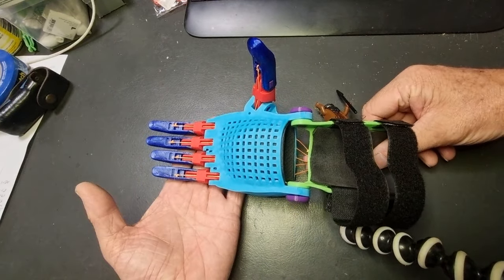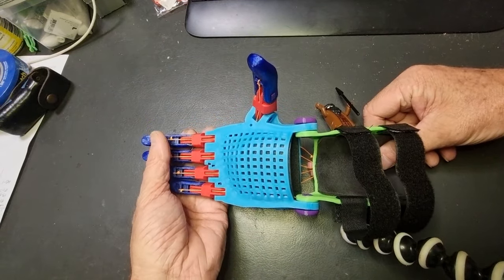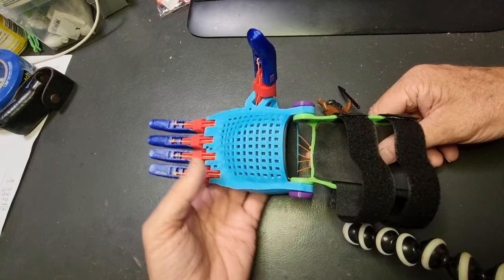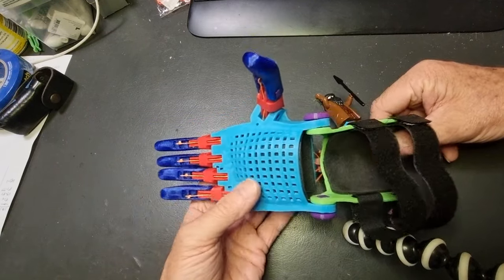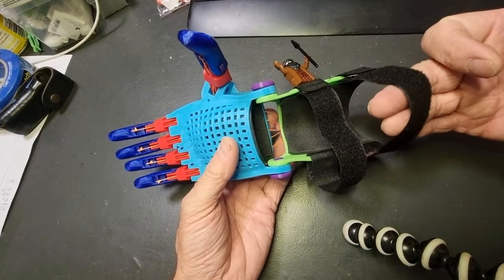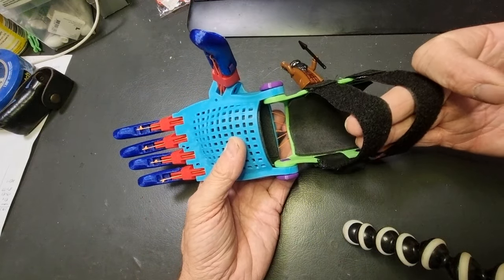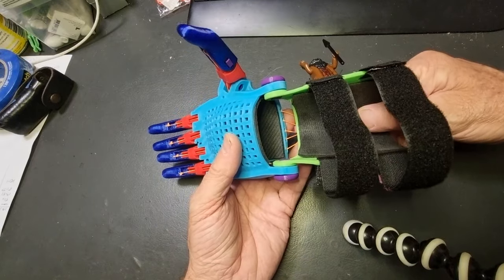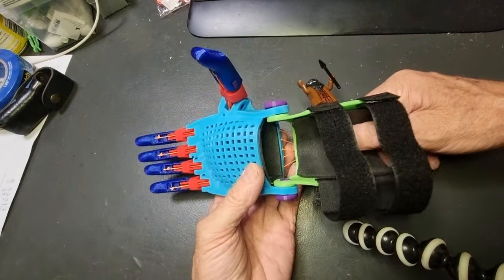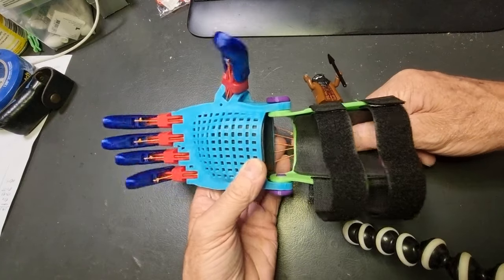Hello everybody and welcome back to another video about my 3D printed enabling the future hand. We've finished the strings, they're all trimmed up and secured front and back. We've got our adjustable Velcro straps fitted to the arm brace, foam padding secured on the arm brace and up inside the cup, and it works like a charm.